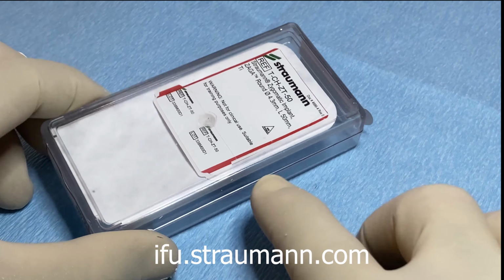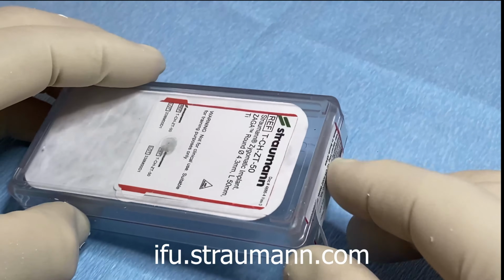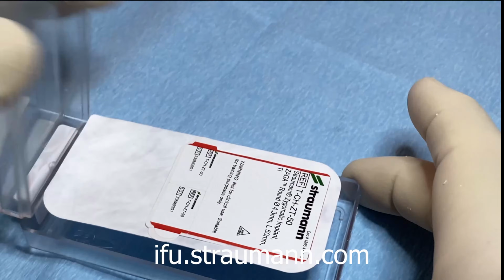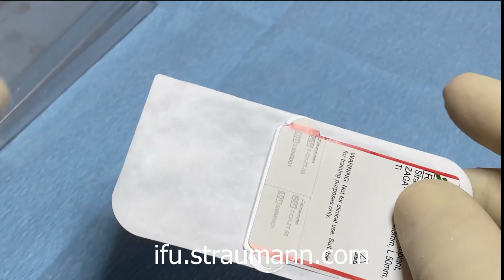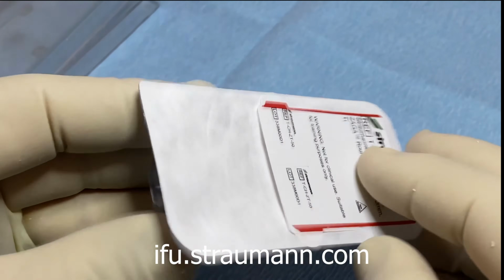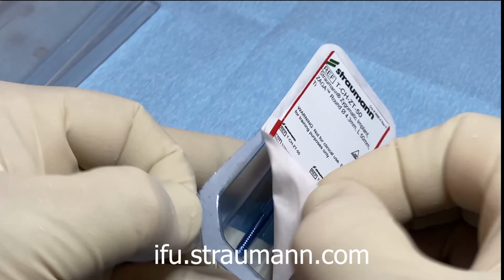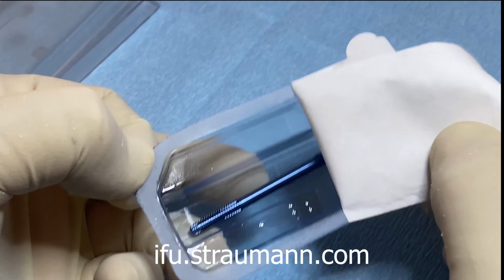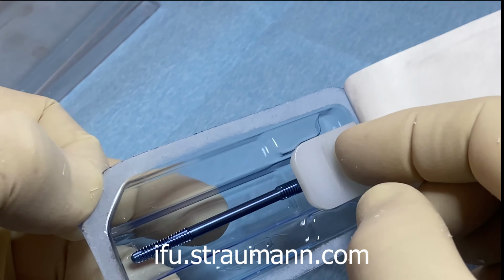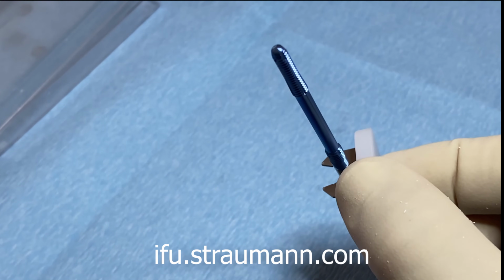So now we're ready for our implant. This is a demo implant, but the packaging is exactly the same as the real implant. The assistants can remove the tags, open up the box, and now sterilely they can open this implant by removing the tab, but not touching the inside part. And what I generally do is I gently grab the plastic holder and I have the implant in my hand.